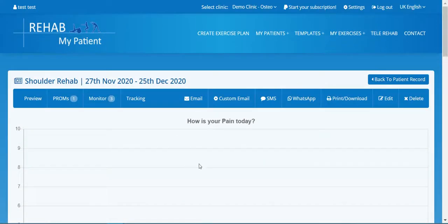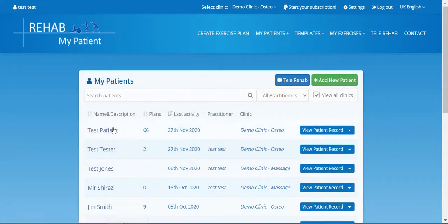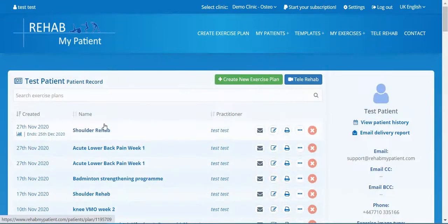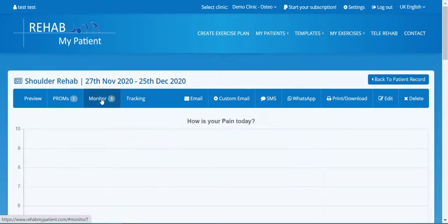Obviously there's no data yet because the patient hasn't filled it in, but this will populate with pain scores. If you want to go back, simply go to your patients, find the patient, and you can see the graph showing the patient reported outcome measures. You can then check the reports from there.